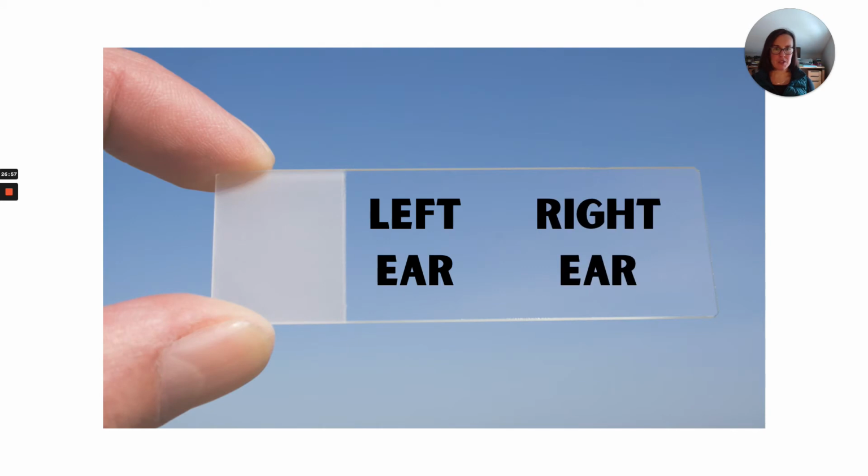And again, this is just highlighting the fact that I put the left closest to the frost and the right away from the frost. Now, you have your own system. You don't have to do mine, but this really works for me. And I like reading the two segments versus the line, and definitely don't collect two slides for your ears. You can do this all in one.